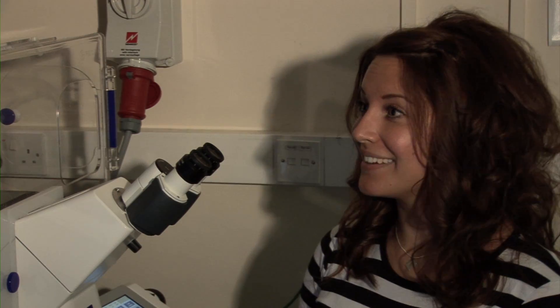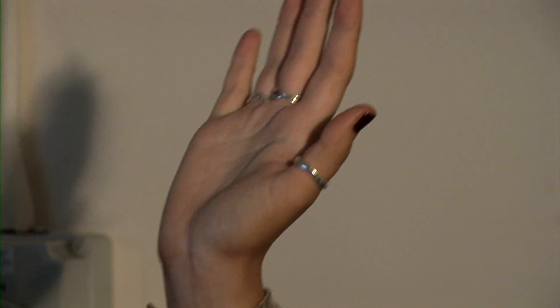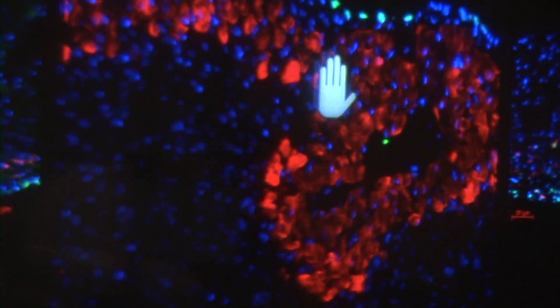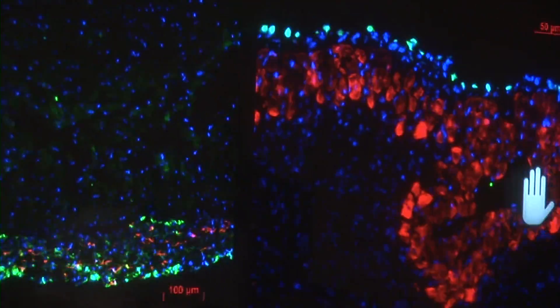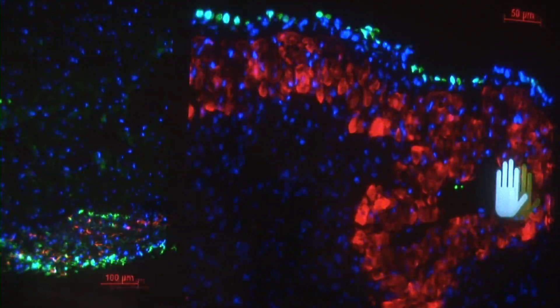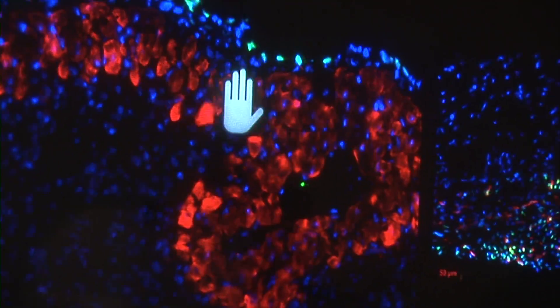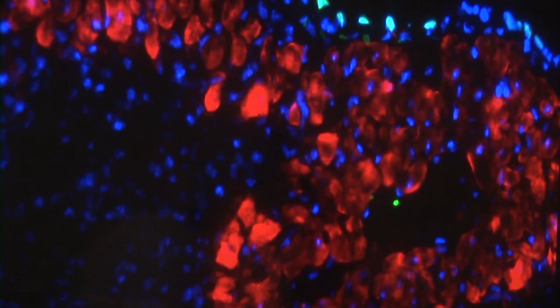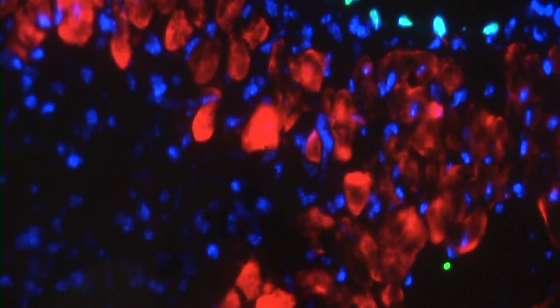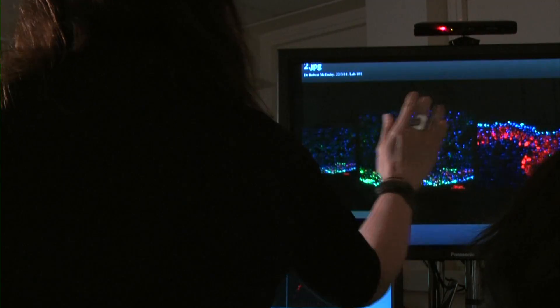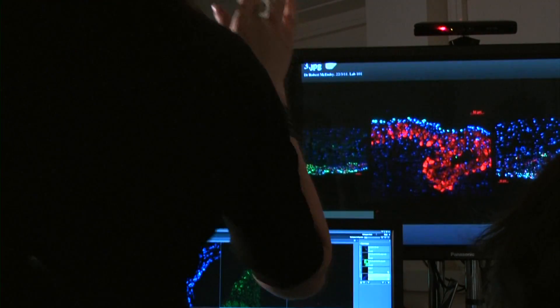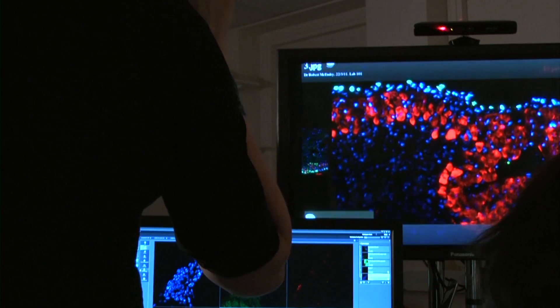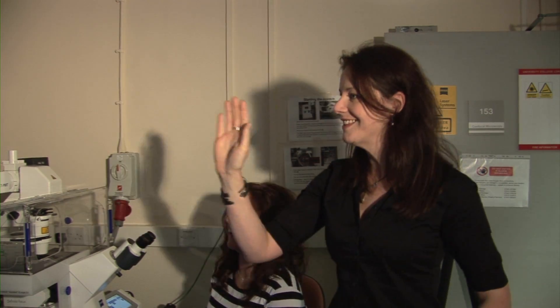So you can still look at images down the microscope. If you want to have a go, raise your hand — and then just left and right to scroll through them. Move your hand back to make the image large, and in and out to zoom. It's like you're doing Tai Chi almost.